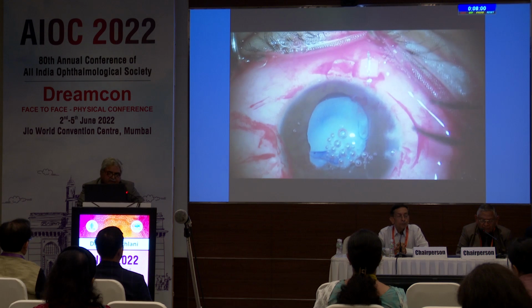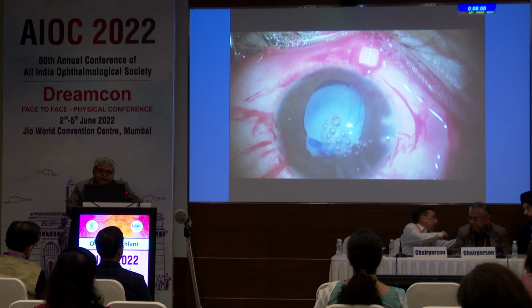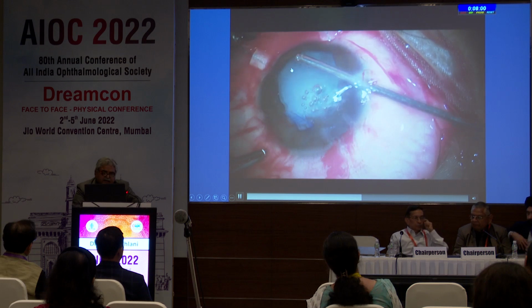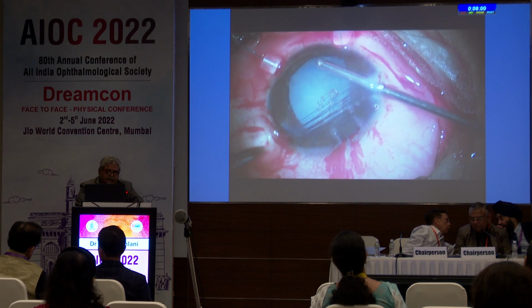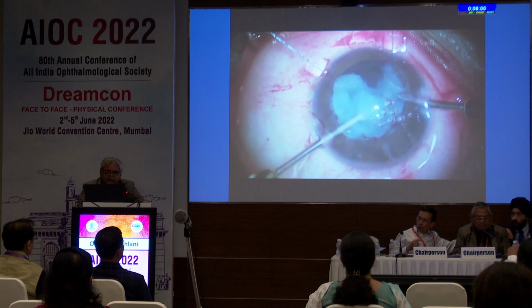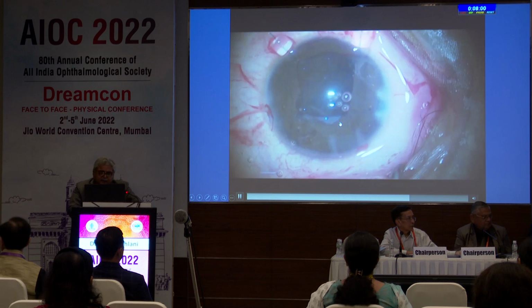So this is how one scissor was taken into the anterior chamber. The access was completed. Later on, the iris hooks were placed to support the capsular margin so that the fluid should not go inside. The zonule was stretched, and whatever vitreous was there, because it was seen in the preoperative examination, the vitreous was taken away from the anterior chamber and the area where it was lying. The important tip here is not to push saline while doing the vitrectomy. The vitreous goes back, and since it was a traumatic cataract, simple irrigation aspiration took away all the cortical material.